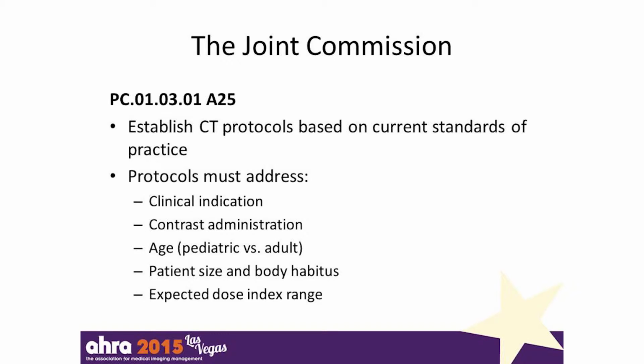The second requirement is that you establish CT protocols based on current standards of practice, and those protocols are to include clinical indication, contrast administration, age, pediatric versus adult, patient size and body habitus, and the expected dose index range. Now that's one of the ones that's making people scratch their heads and saying, well, how do I set the expected dose index range? We'll give you some more information on that later as well.